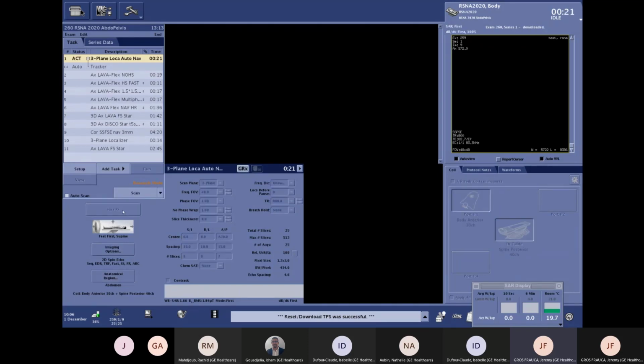So, as we said, we are talking here about body imaging. Today let's focus on liver imaging. You have a lot of advantages of performing MR for this kind of examination. You have a lot of different contrast available, a really nice contrast-to-noise ratio. You can make some dynamic study and also quantitative study.